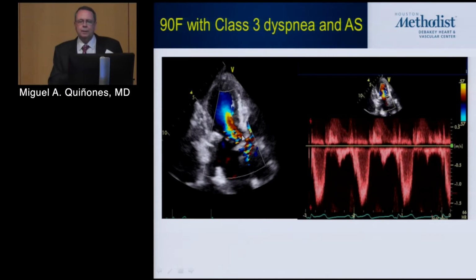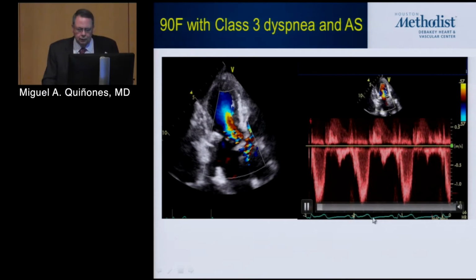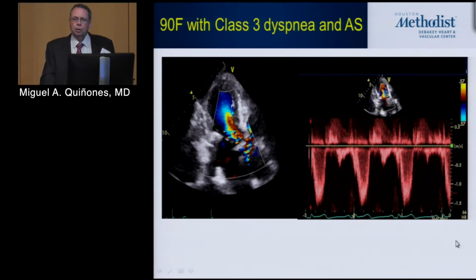The congenital pediatricians know this very well, because in a lot of pediatric diseases you have this type of tunnel, this type of narrowing. 4V square goes to hell, okay? Look at the LVOT velocity, over 1.5. So these things do happen, and if you don't pay attention to details, you can get in trouble.